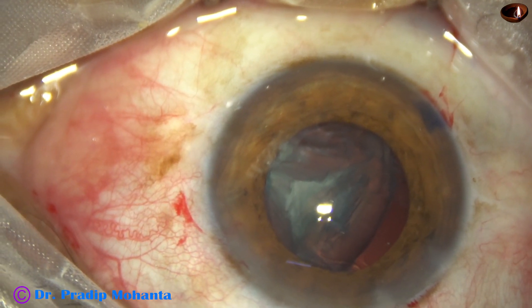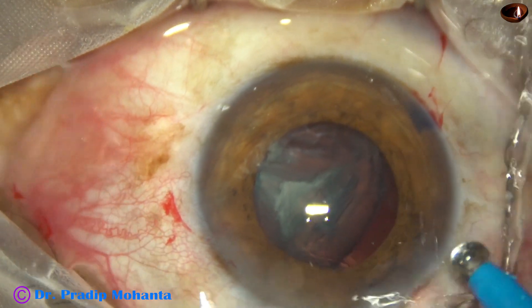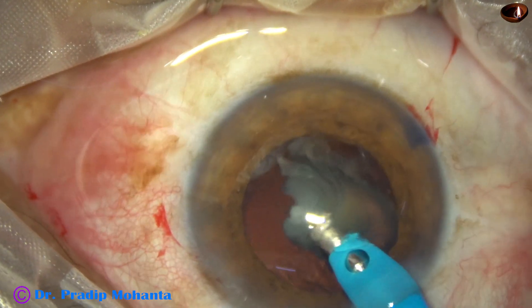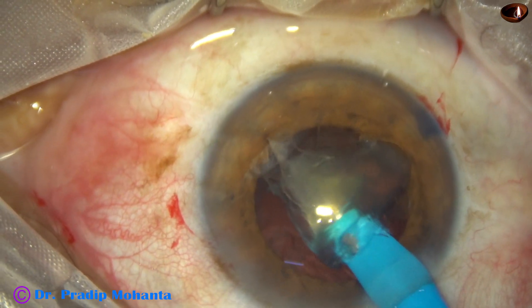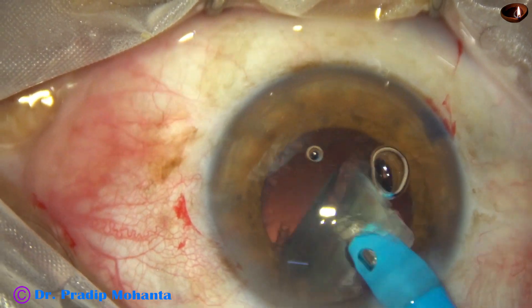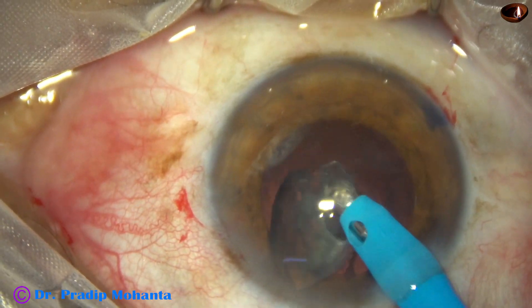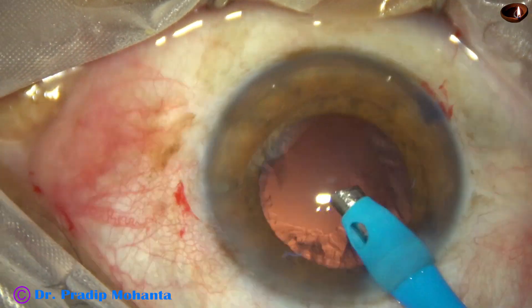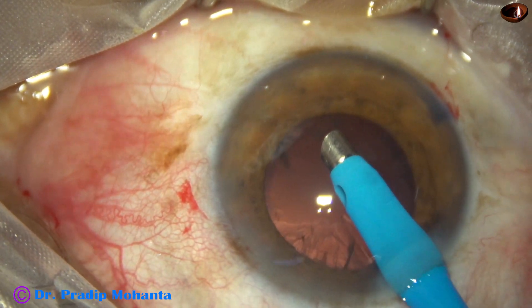I used some visco all around the piece. Hold the piece and emulsify at lower vacuum. I have emulsified the other pieces with 450 vacuum, 45 flow rate, and 60 percent ultrasonic energy. And this piece at 50 percent ultrasonic energy, 300 vacuum and 30 flow rate.